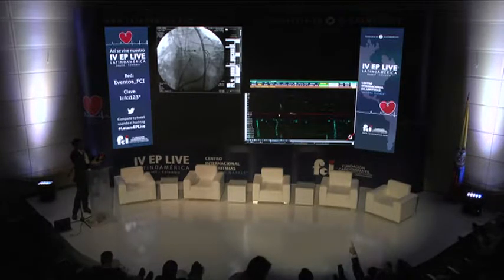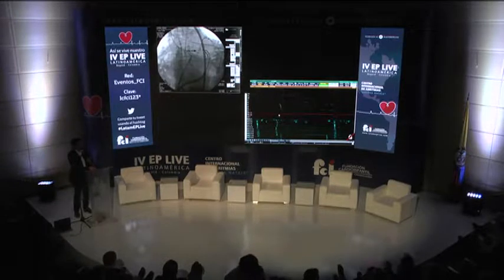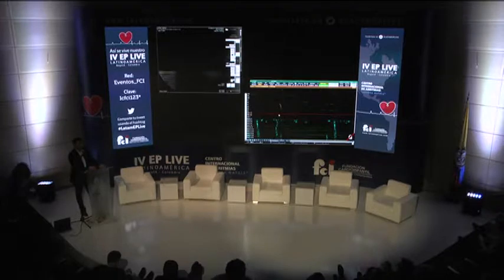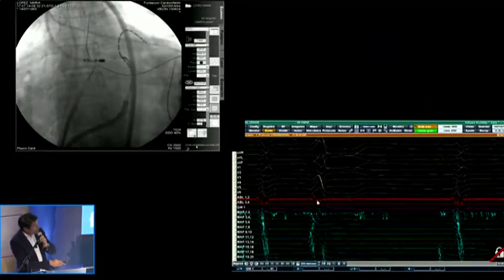And the new software for automated records, such as Rhythmia, etc., is based on combined unipolar and bipolar analysis. Any further comments? Well, we have to decide what to do now. Fermin, there is a question for you. We need a microphone for the question.